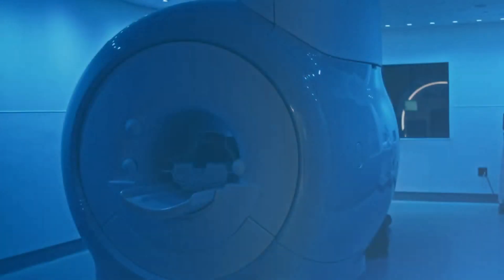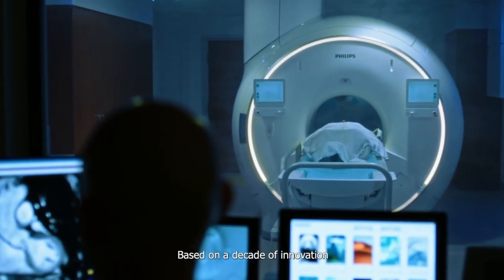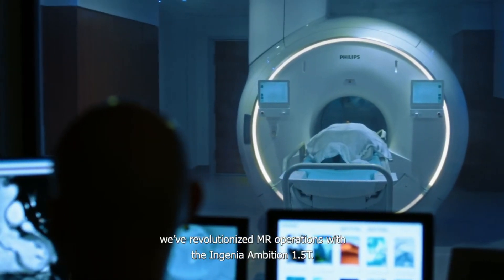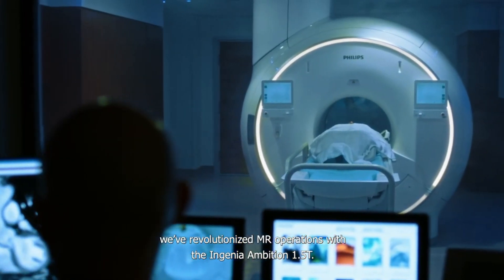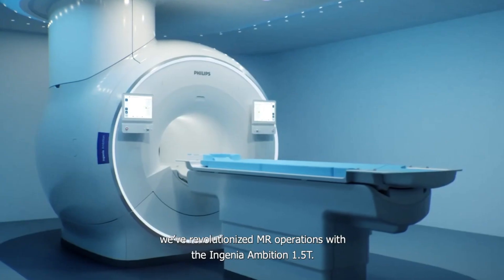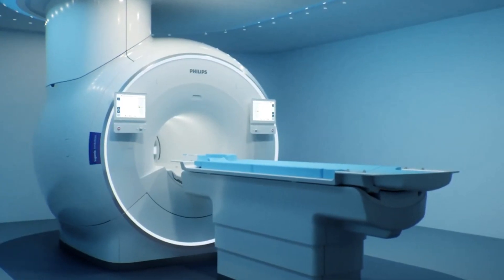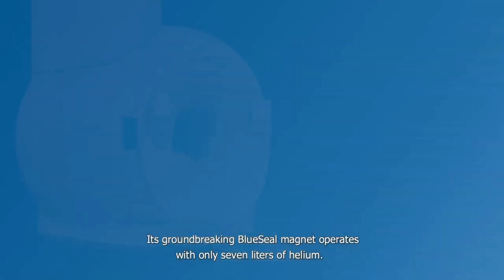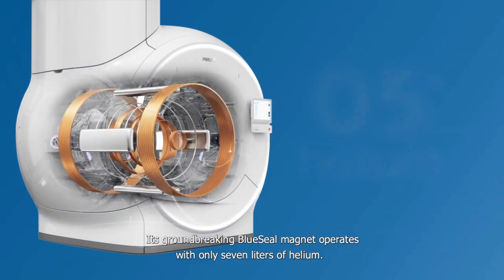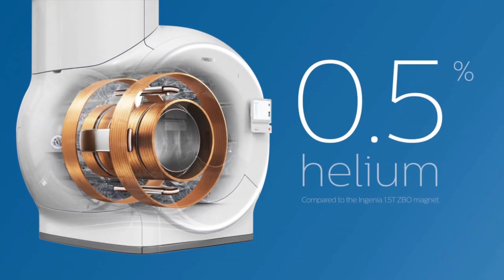Standard high-field MRI scanners not only require hundreds of liters of helium in which to bathe the superconducting magnet, but need regular top-ups as helium leaks away. With declining reserves and increasing prices, finding an alternative solution was critical.